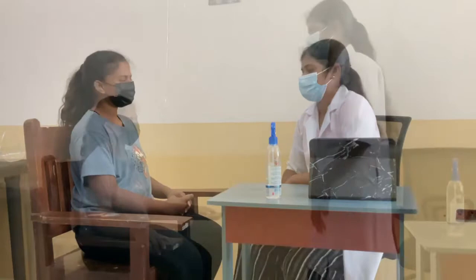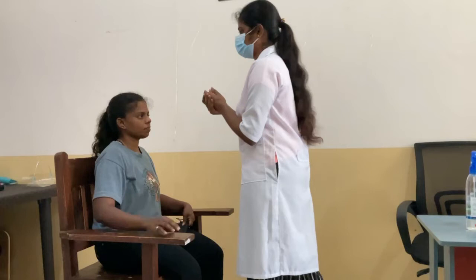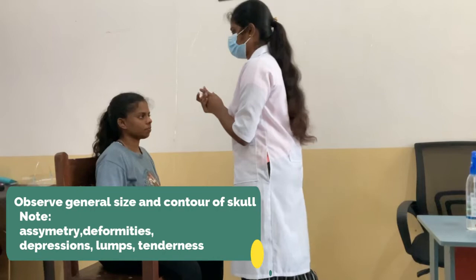In doing the examination of the head and neck, it requires the use of several special instruments to inspect the eyes and ears, and special techniques to assess their special sensory function. We must first use our eyes to assess for any obvious findings. Some questions to ponder are: what is the general appearance of the patient? Does their face have symmetry and facial drooping? Are there any stark findings such as ptosis or a goiter?